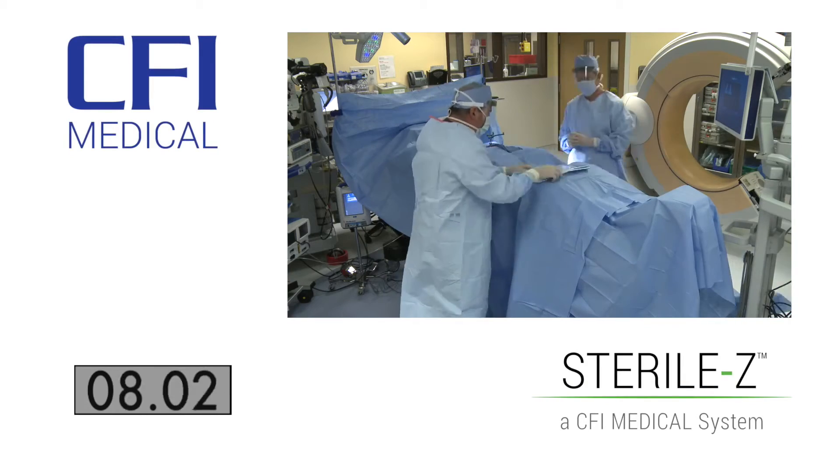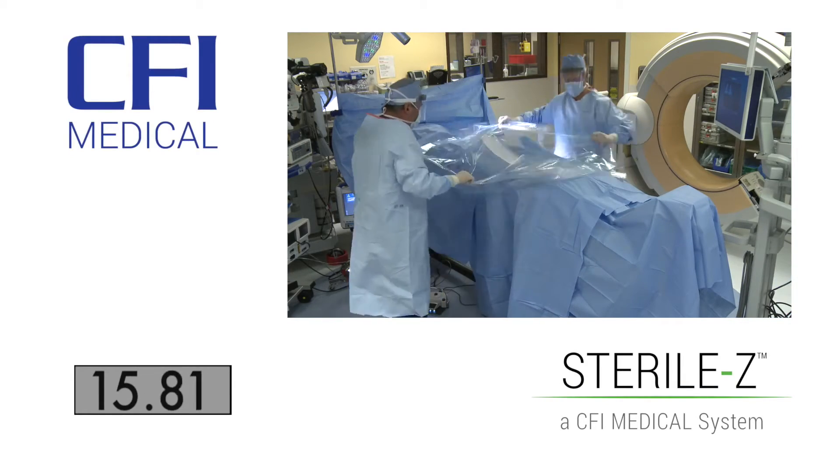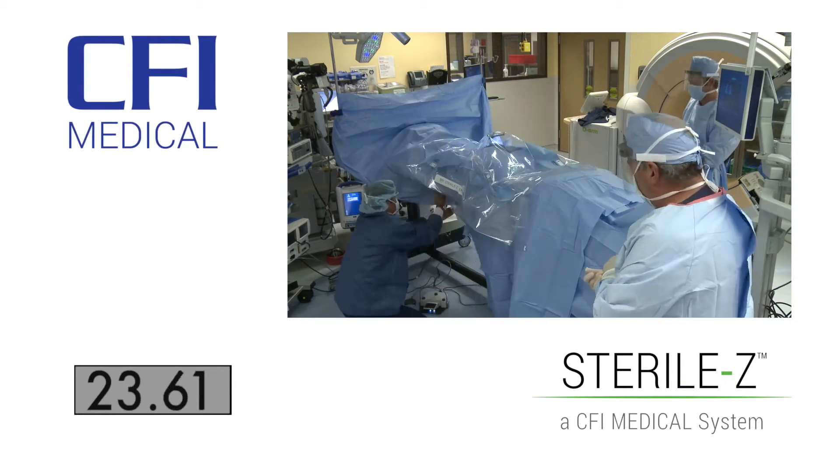We developed the SterilZ patient drape for the main reason that there is no current draping system on the market that protects a patient during spine surgery when using a 3D radiographic device in regard to safety and efficiency. The SterilZ patient drape makes surgery much more efficient as well as increasing sterility, so it has multiple purposes. The entire process of encompassing the patient in the sterile field is literally 30 seconds.